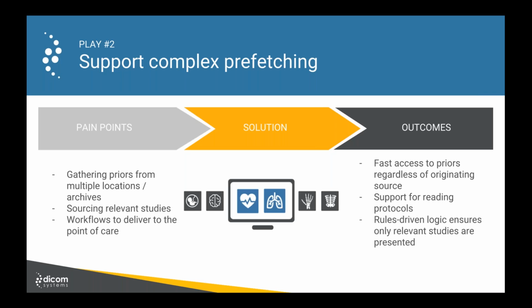Previously, our tool only allowed us to fetch based on a modality match. So obviously that doesn't work most of the time. And when we would have missing prior examinations, we would need to contact our client and ask them to manually push cases to us. Now, this is a number of years ago, but you can imagine all the hospital technologists with all the work that they have to do, also having to push cases to a radiology group. That wasn't their idea of a good time. So we needed to find a solution that would allow us to more intelligently fetch prior examinations.